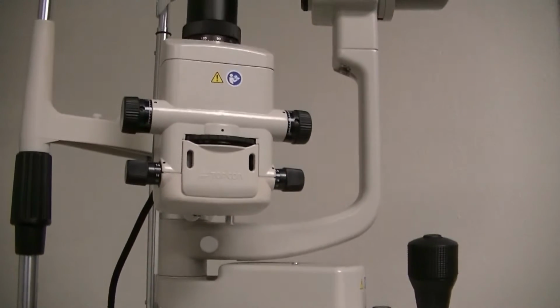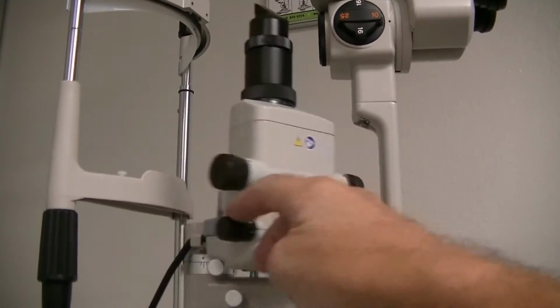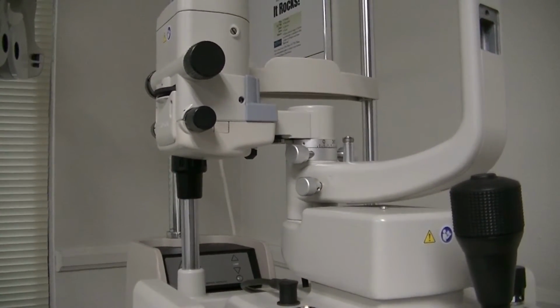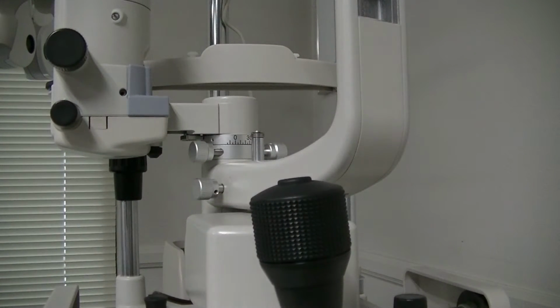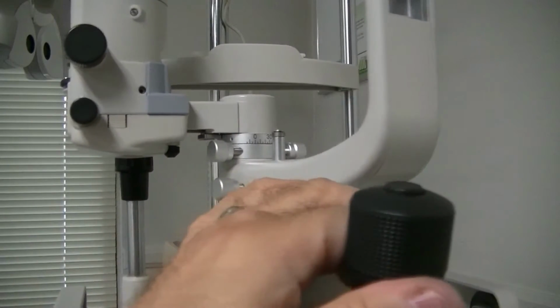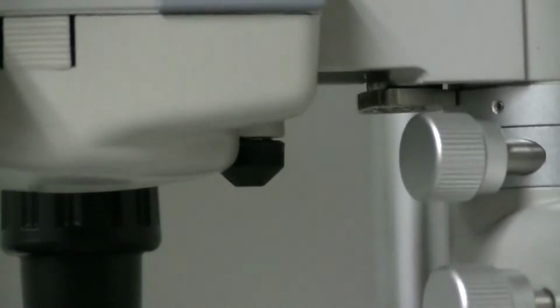This is an overall shot of the base of the slit lamp. And this is the lighting tower right here. And on the bottom of the lighting tower, if you can see it, I'll swing the camera around. Right here, there is a little black screw. It's actually a knurled knob. And that's the best you can see it. I can probably zoom in a little bit on it. Right there.